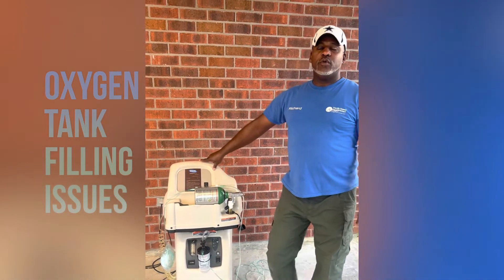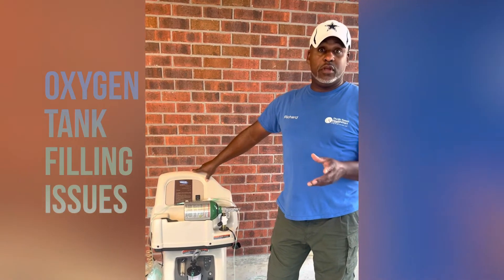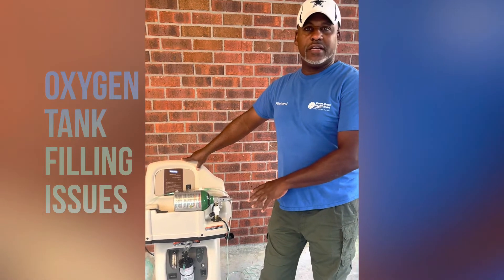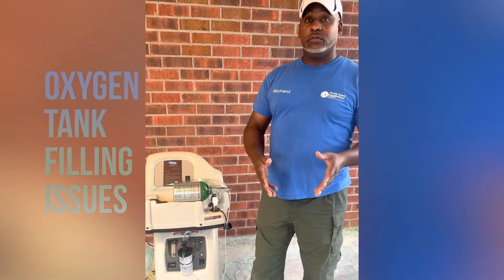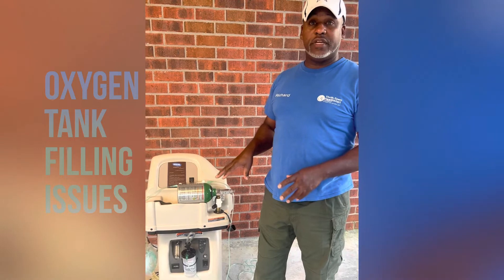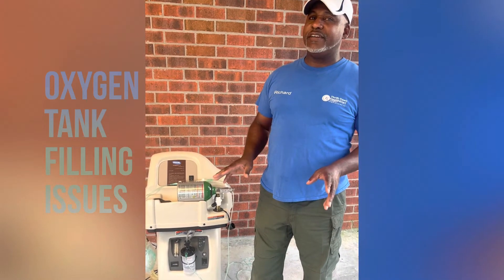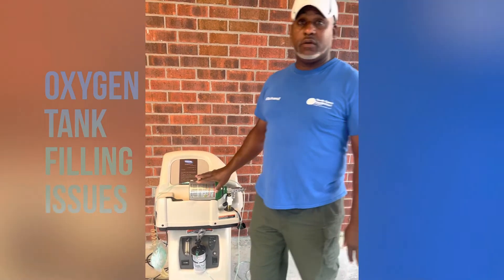This is Rich with Thrift Town. We're going to go over a few questions that may come through in the middle of the night about filling a tank or something dealing with your oxygen. This is just some things to know whenever a call comes through — we'll do some troubleshooting with you over the phone just to enlighten you and let you know you don't have anything to be afraid of or scared about. If nobody can come out, we can go over a few things with you right before.